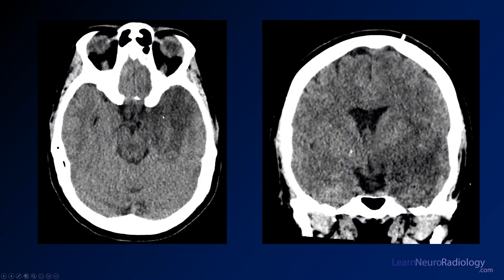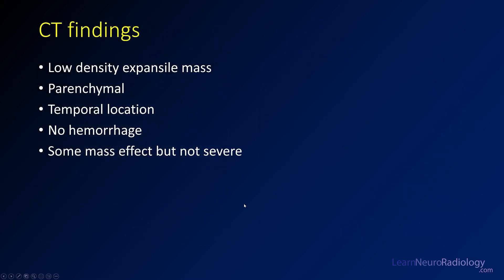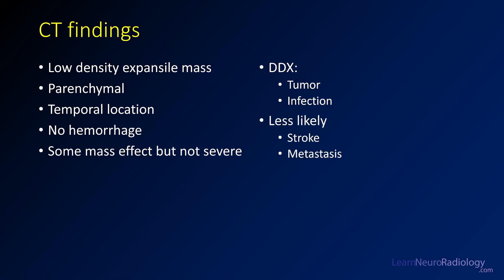Here are some additional stills from that CT. You see a low-density lesion in the medial aspect of the temporal lobe, involving the basal ganglia and temporal stem. It's a low-density mass in the parenchyma of the temporal lobe and insula. There's not really any hemorrhage, some mass effect but it's not severe. In the emergent setting, your differential should be tumor or infection. Stroke is less likely as it doesn't follow a vascular distribution. Metastatic disease is possible but it's solitary with no other masses seen.